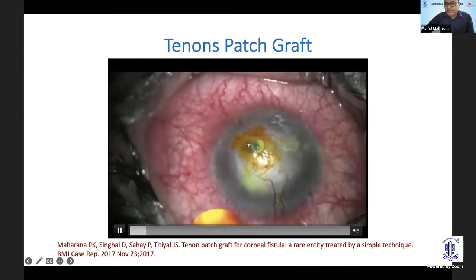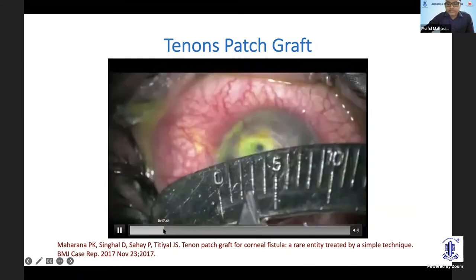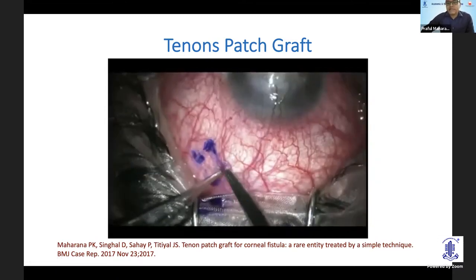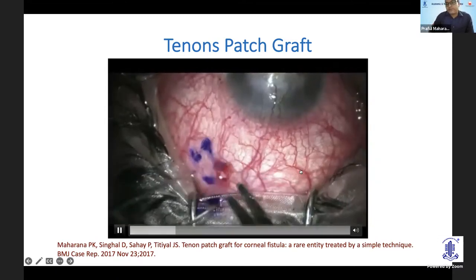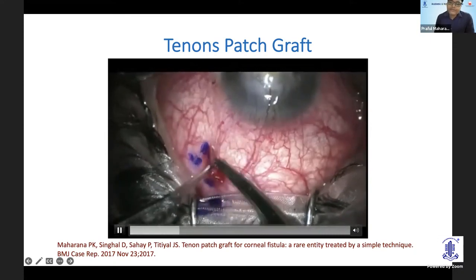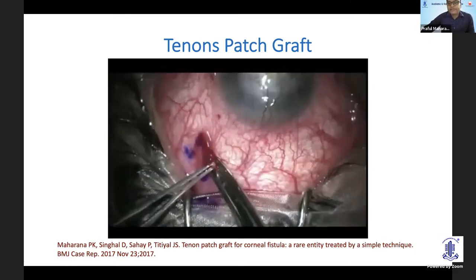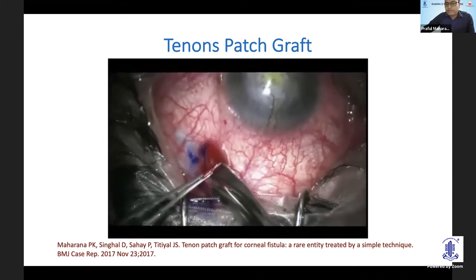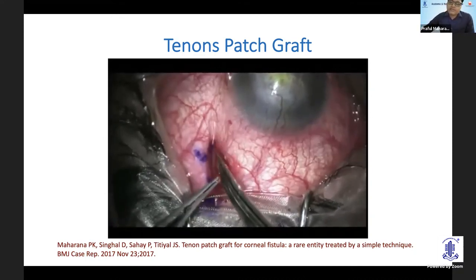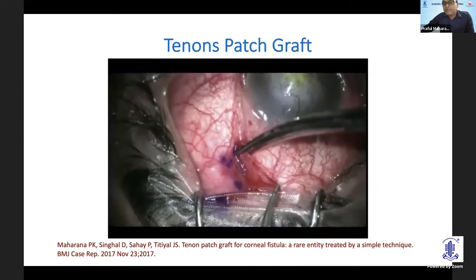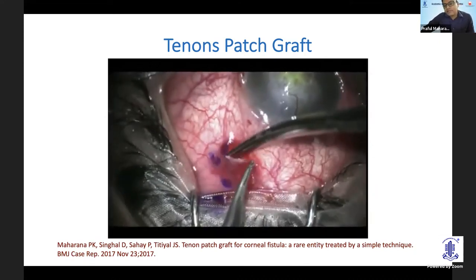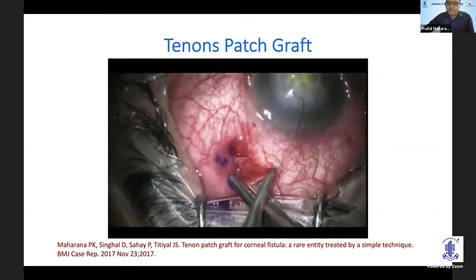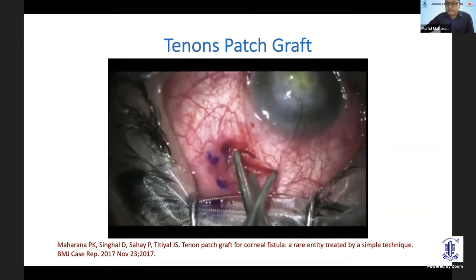You can see there is a leak and the perforation is almost 2x2 mm in size. First you have to measure the size of the defect, then take either the supratemporal or supranasal quadrant, do a peritomy, and try to separate the tenon's tissue both from the conjunctiva as well as the underlying episcleral tissue. It's not a very difficult procedure — easily done if you have done ECC or any conjunctival surgery. The idea is to take a slightly oversized graft compared to the size of the defect.